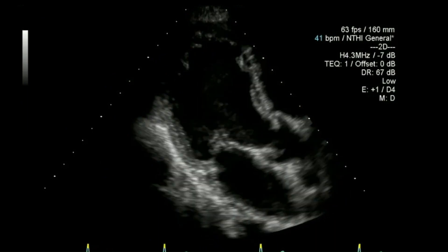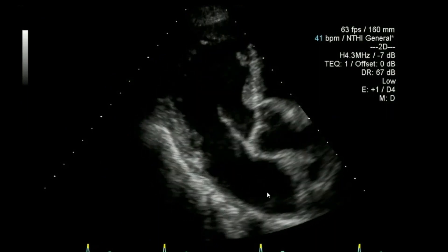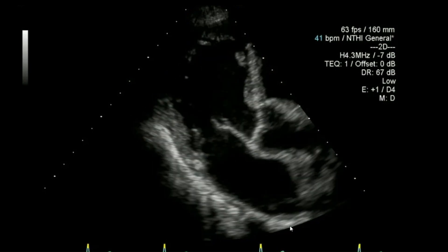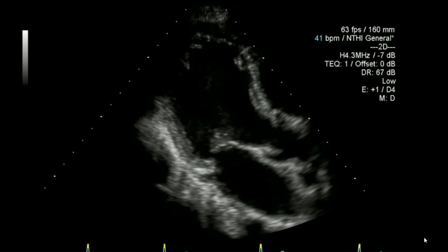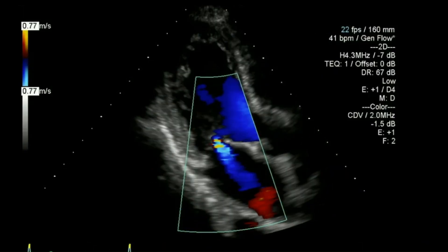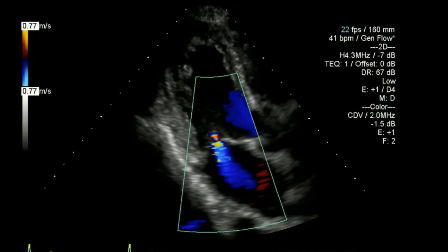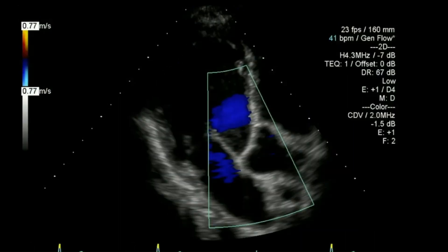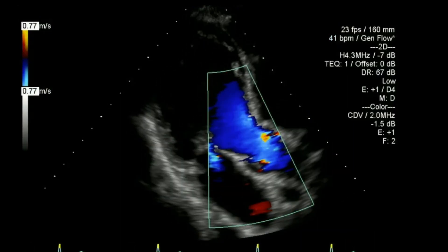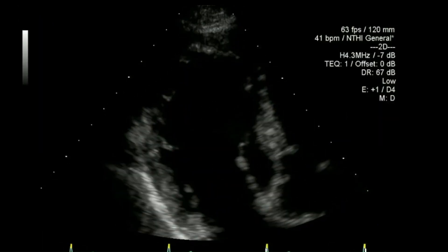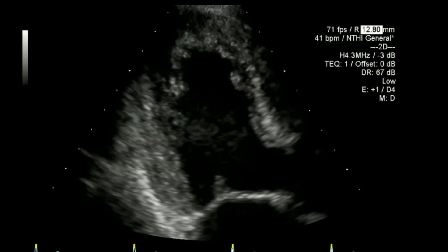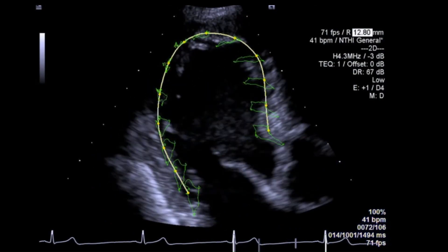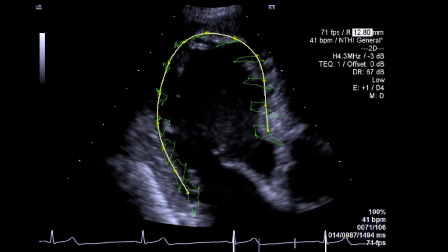Rotating around into the apical long axis view — again one to two centimetres behind the heart with sector width narrowed so I can still see all the structures I want but to maximise frame rate. Looking at colour flow for mitral regurgitation, then moving my colour flow box across to focus on aortic flow. I've also zoomed up a bit closer to maximise image quality for measuring global longitudinal strain.